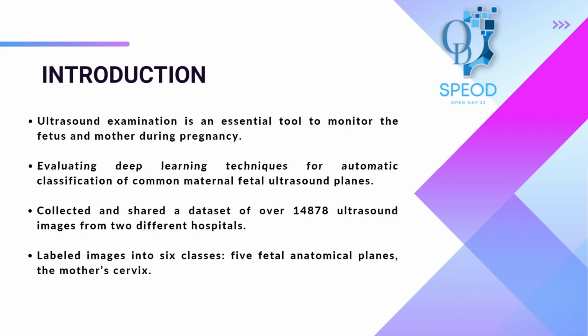We have trained our models using 14,000 plus images from two different hospitals, and we have labeled the images into six classes. Five of them are fetal anatomical planes, and the sixth one is the mother's cervix.